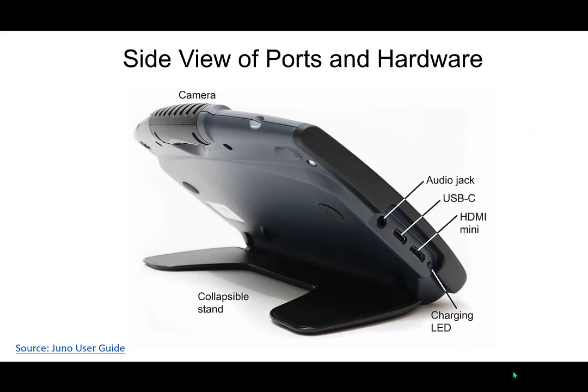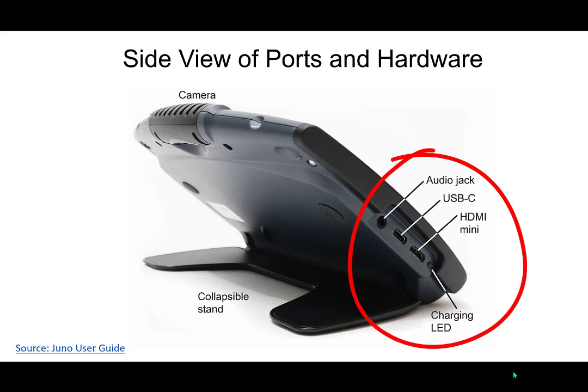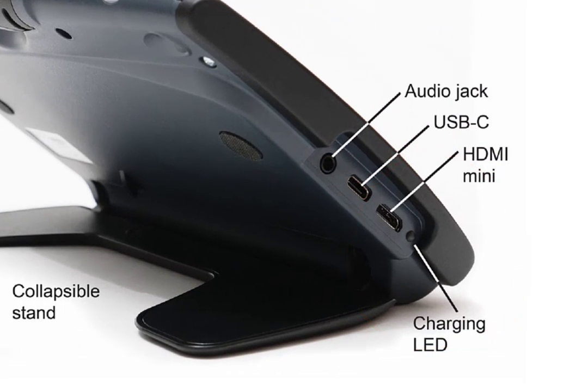Okay, now let's look at the side view of the ports and hardware. If you look on the left side, in this recessed compartment, there are several ports. The top port, which is the furthest away from you and the furthest on the top, is the audio jack. You can tell because it's circular, just like an audio jack would be. You just plug a set of headphones in there and you could hear your menus and things in your headphones instead of through the speaker. The next port down is the USB-C port. This port is used for charging.